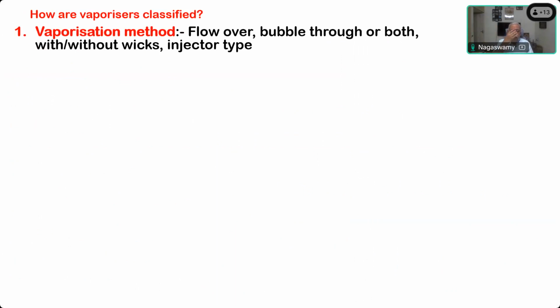And the modern vaporizers all have wicks. You know, wicks means tiri in Tamil. Just like the Schimmelbusch mask having the gauze layer, the same woven material is spread into the vaporizing chamber to increase the surface area. About 150 years ago, people thought of using gauze for vaporization. The same thing, if you make it into a wick-like thing, it becomes wicks.